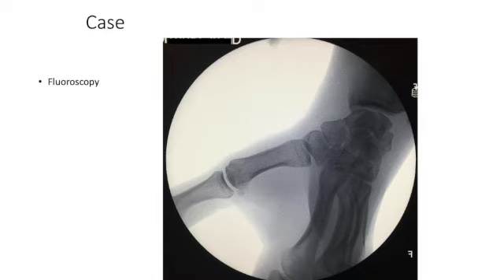So looking at this view, we see a little bit of a fracture line right at the scaphoid. And that's exactly what was happening with this individual. He suffered axial loading from the bench press accident, which then caused a scaphoid fracture. I will say that this is typically going to be one view. We're going to typically get another view on top of this. Remember, one view is no view. As you can see from the big blue arrow, not that you guys needed it because you're all experts now, that fracture line right at the scaphoid is very indicative of a scaphoid fracture.